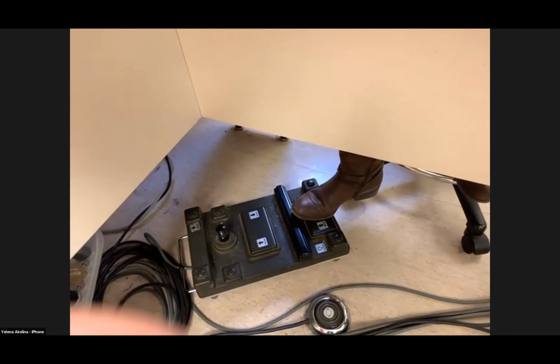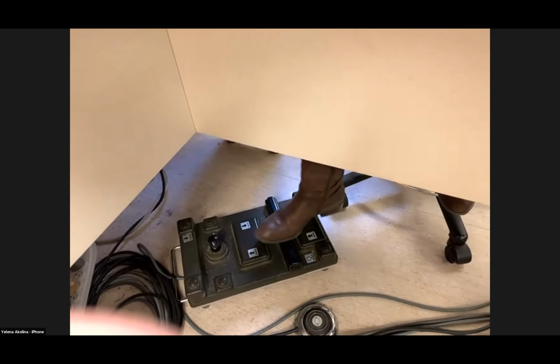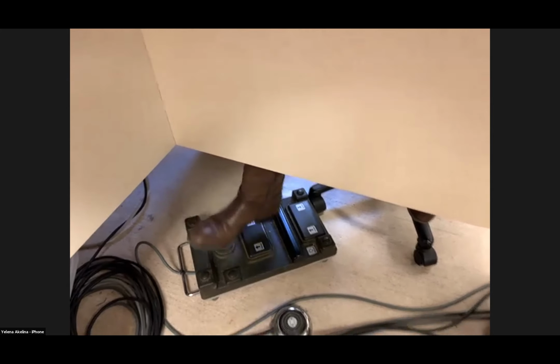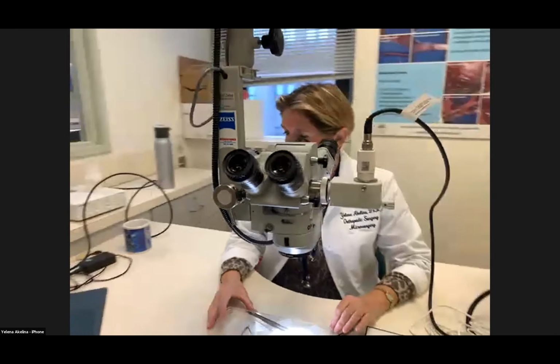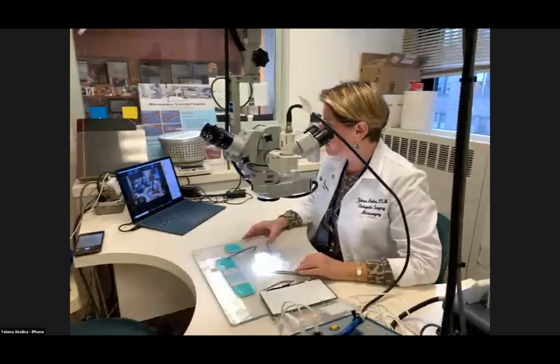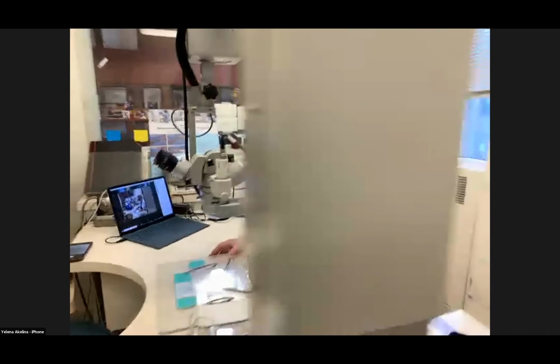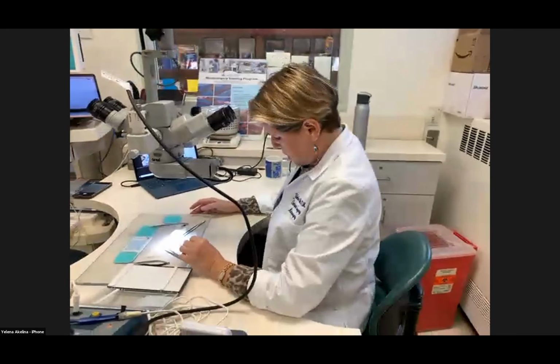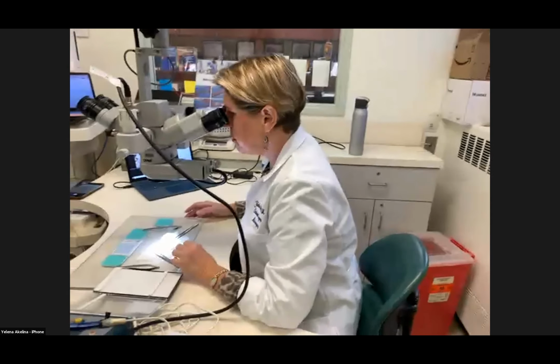So I can bring the microscope lower or higher using this pedal. So if you see, I can move the microscope here and here. You'll see the microscope goes down or goes up. All right. So you have to be within a 20 centimeter focal length to be able to focus.